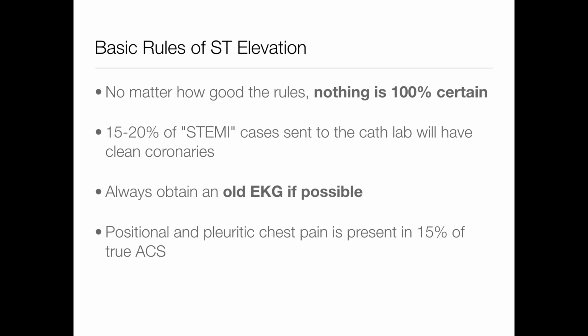The other thing to consider is no matter how good these rules are, nothing is 100%. Almost 20% of so-called STEMI cases that get sent to the cath lab, once they get there, they've got normal coronary arteries. So we overcall STEMIs all the time. I guess better to overcall than undercall it, right? So, hey, just be on the safe side, call the cardiologist, let them get a good look at the 12 lead, let it be in their hands, okay?